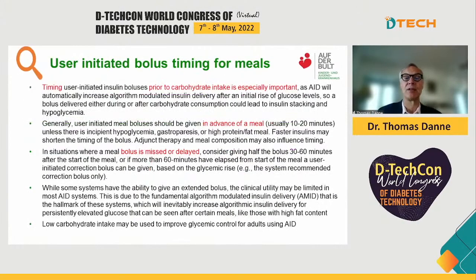Now, it's very important to still give the bolus in advance of the meal, because we need to understand that if the glucose is rising, obviously this automated insulin delivery will deliver more insulin. And this is quite different from the previous systems, where basically the basal insulin was pre-programmed and didn't change. So if a bolus is missed or delayed, one has to appreciate that a part of the correction is already given. And so there is the inherent risk of hypoglycemia if you delay your mealtime bolus.